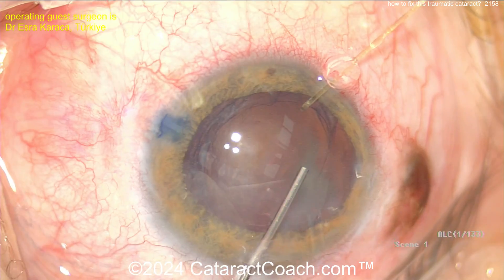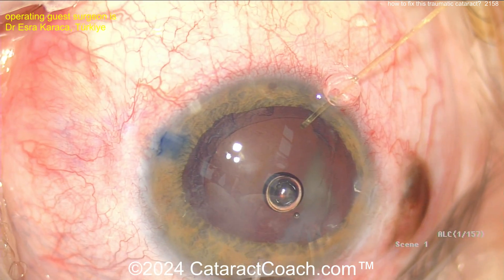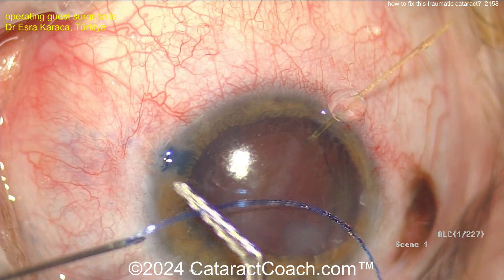Sometimes in a case like this, doing a pars plana approach — just have infusion in the AC and then have a trocar placed at pars plana to help pull the vitreous back down — is helpful.